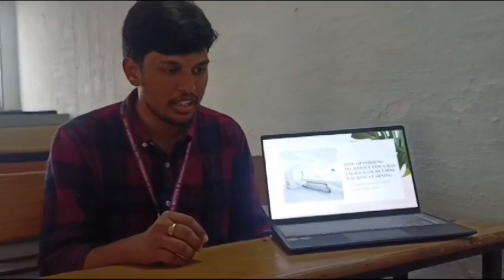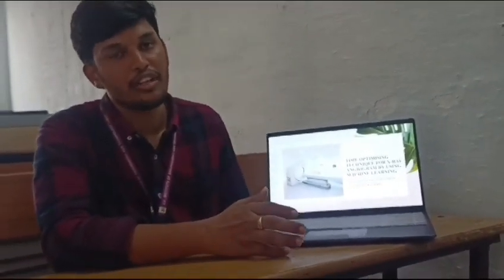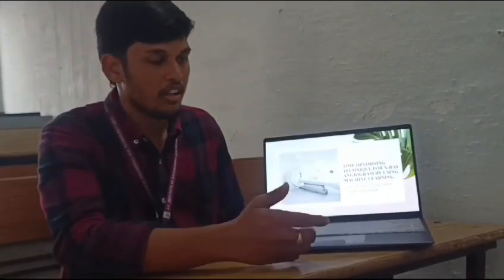And we are also using image computer vision for finding the blockage in the images. We are using libraries like Matplotlib and OpenCV for completing our project. With the help of those two libraries, we have completed our project successfully, and our code is in Python. So we will introduce the images from the hard disk into the code, and then we can run. So this is our code.